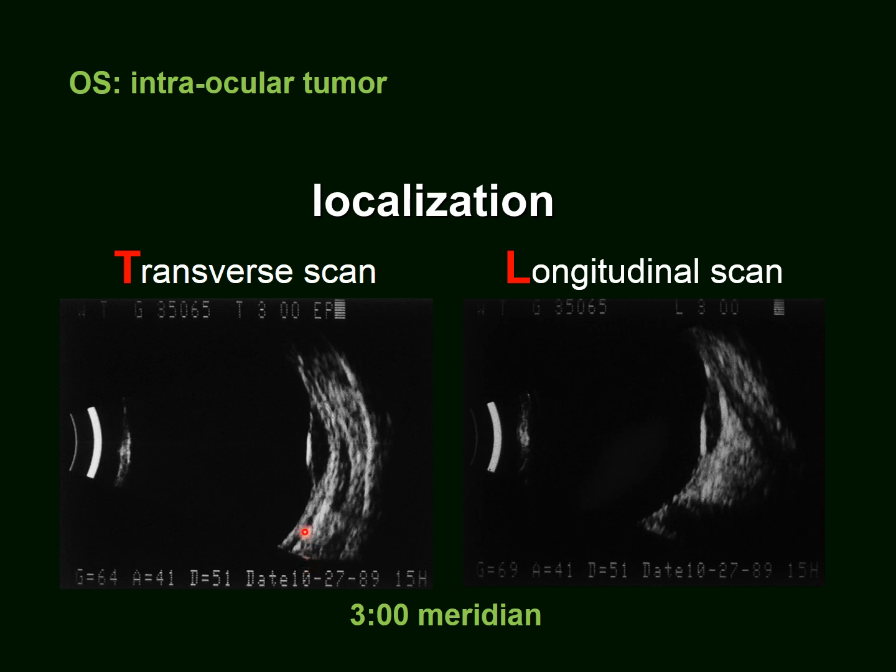What is this here? Could that be an extension of this malignant tumor into the orbit? No, it was another extraocular muscle, a typical pattern for the insertion of the inferior oblique muscle. It is very important for the echographer to know the topography of the extraocular muscles well, even when one examines only the posterior eye segment.